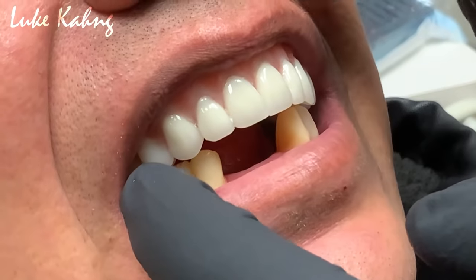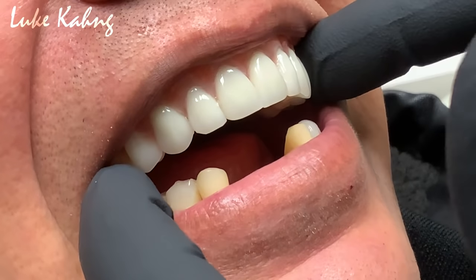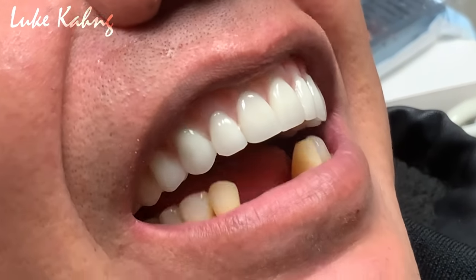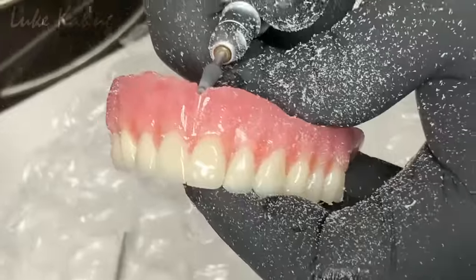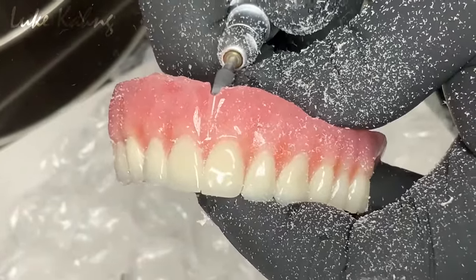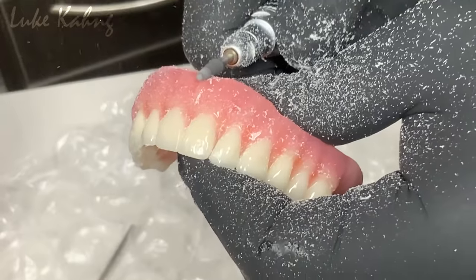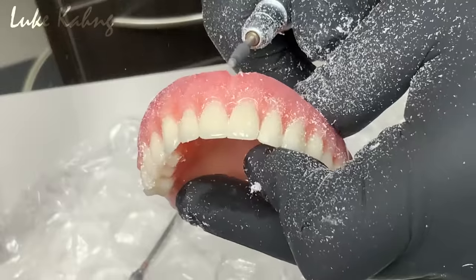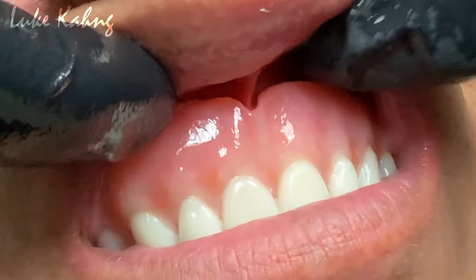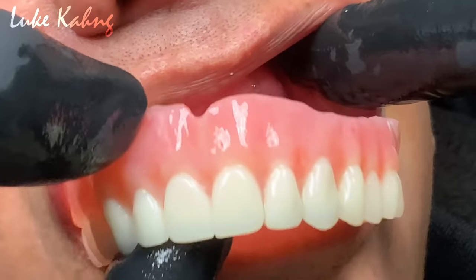Okay. But he's saying that it feels good. All of the flanges, the sulcus, everything up here feels nice and comfortable now. Some of the areas that were of concern for him have now been relieved much better. See? You got it? Okay. Enough room there. See? It's nice. Just enough room. Just enough. See? Got it? Look at how real that looks. Beautiful. It blends right in.